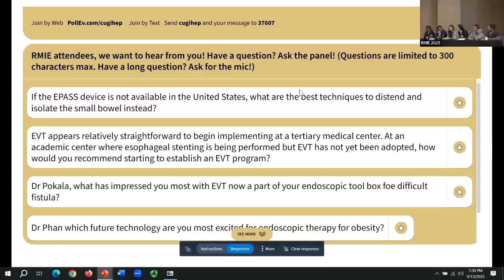It's actually been many years since I placed my last duodenal stent for an inoperable malignant obstruction. But I still place fully covered duodenal stents for benign conditions because we are still waiting for further data on the use of EUS-GE for benign conditions. There are two exceptions, maybe afferent loop syndrome would be one, and the other would be SMA syndrome. But apart from those two, you have to be very cautious because we just don't have the data to justify doing that.